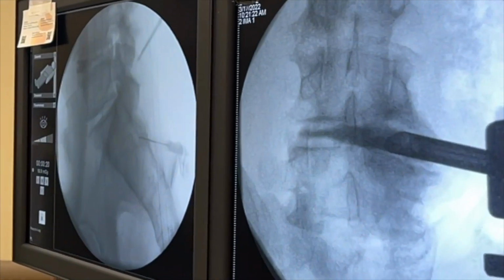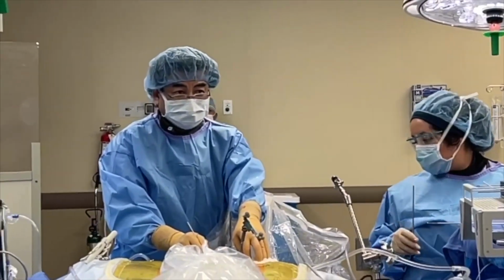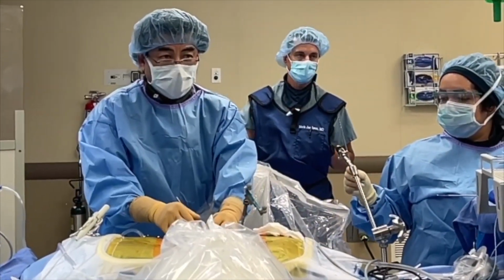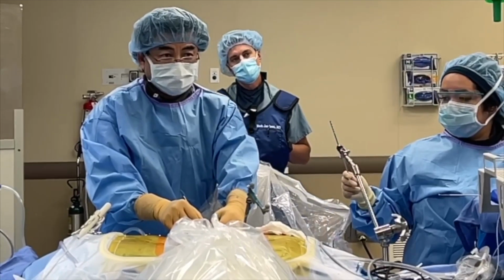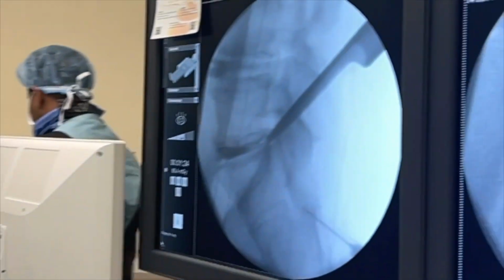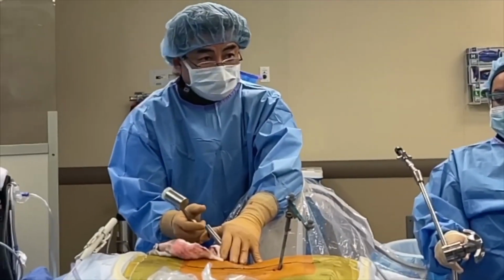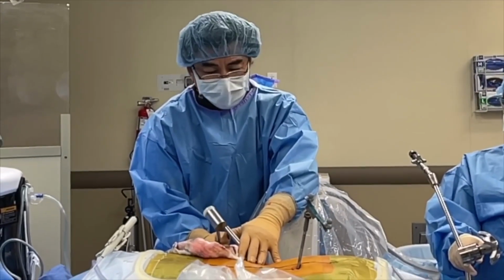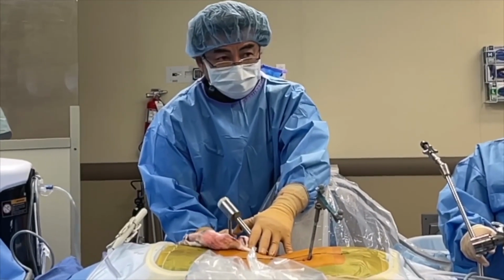L4-5 went beautifully, if I do say so myself. I really hope L5-S1 goes the same. Entering the L5 neuroforamen, Brittany, and loving it. Yep, exactly. Surfing down the bone with the Wolverine. Because, you know, professional golfers have custom grips, shafts, and lie angles for every one of their clubs. And so do professional spine surgeons.